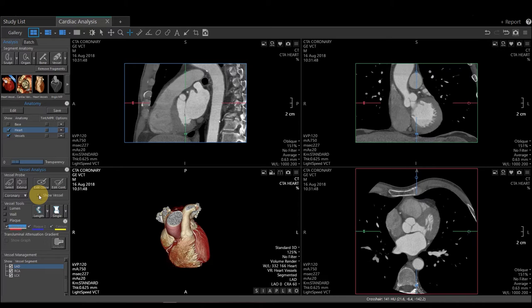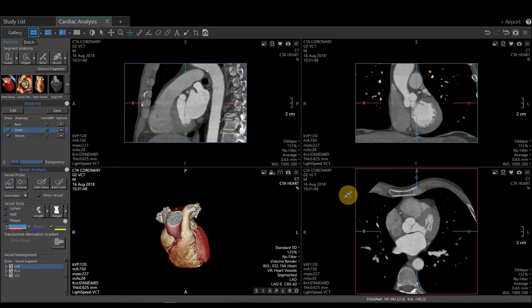I'm mainly going to be working with my two-dimensional images at the beginning. We have our blue, green, and red viewports. Blue is going to be our sagittal, green is coronal, and red is going to be axial.